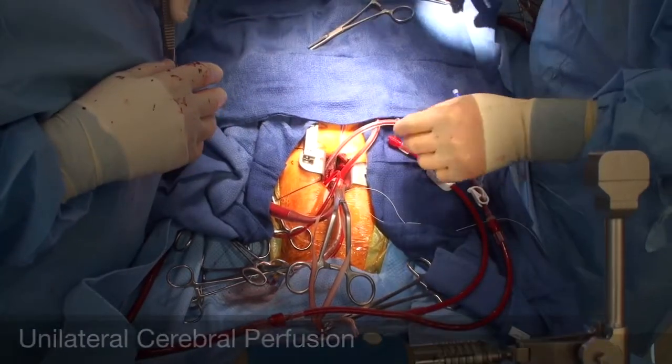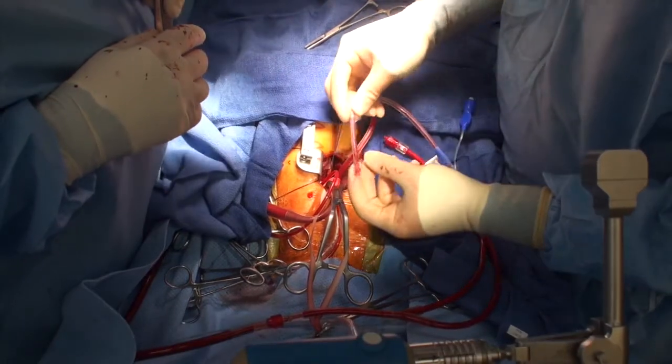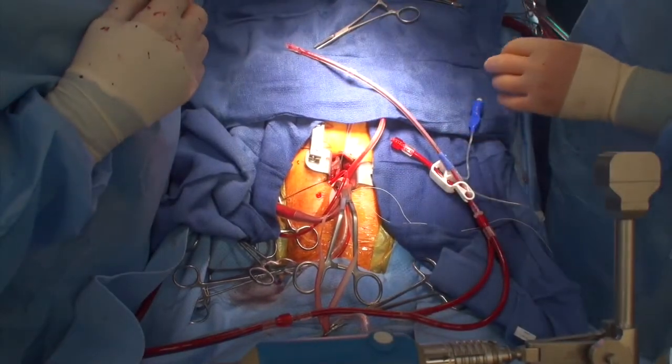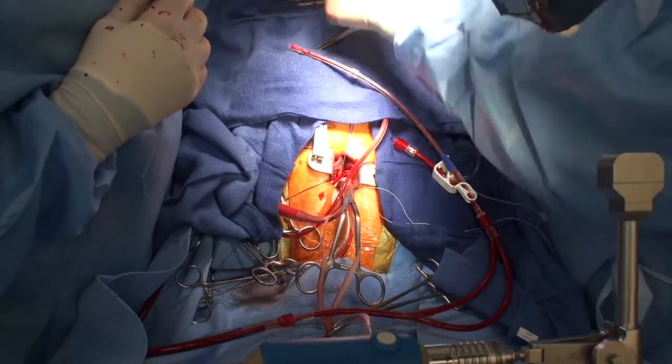We'll just use unilateral cerebral perfusion for now. We'll measure roughly this much into the innominate. Anything beyond that — if we push too far forward — the common carotid may not be perfused.